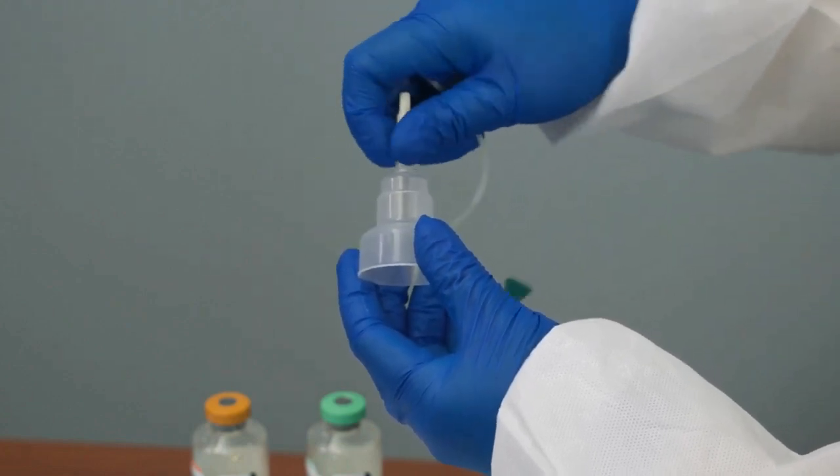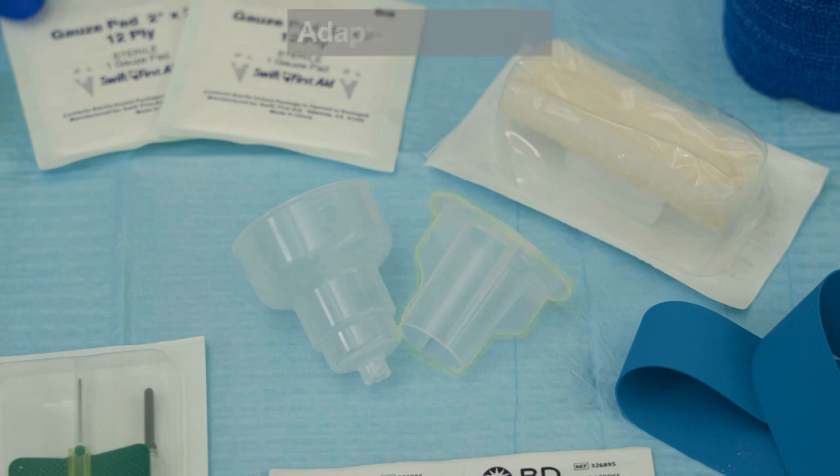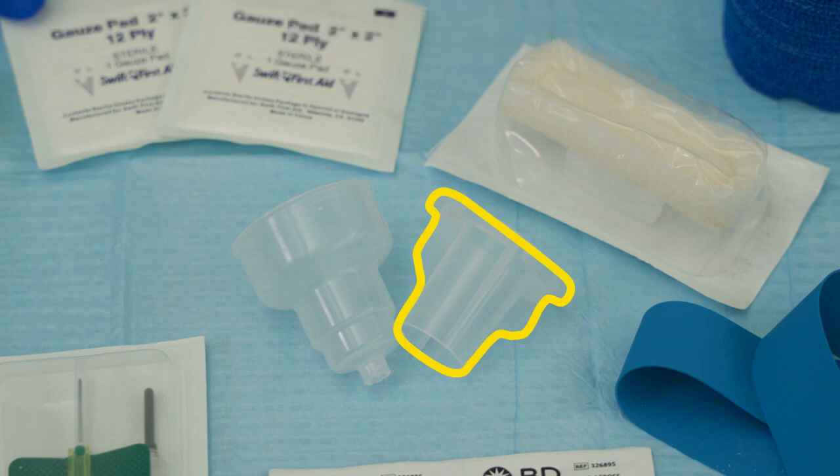Attach the set to the collection adapter cap if it is not already connected. Note: the adapter cap may have an insert that needs to be removed when collecting blood cultures. The insert will be used if additional blood test tubes are needed.